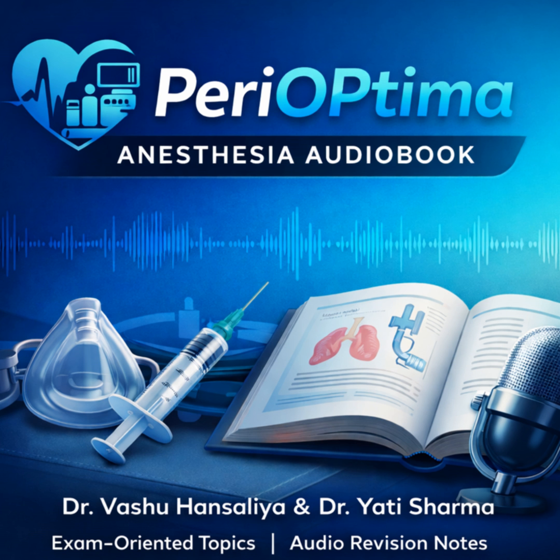Precisely. To keep the patient anesthetized, you have to do a cognitive correction. You have to manually increase the concentration on the dial to compensate. It's a critical manual override for an automated system. That is a perfect Viva trap.